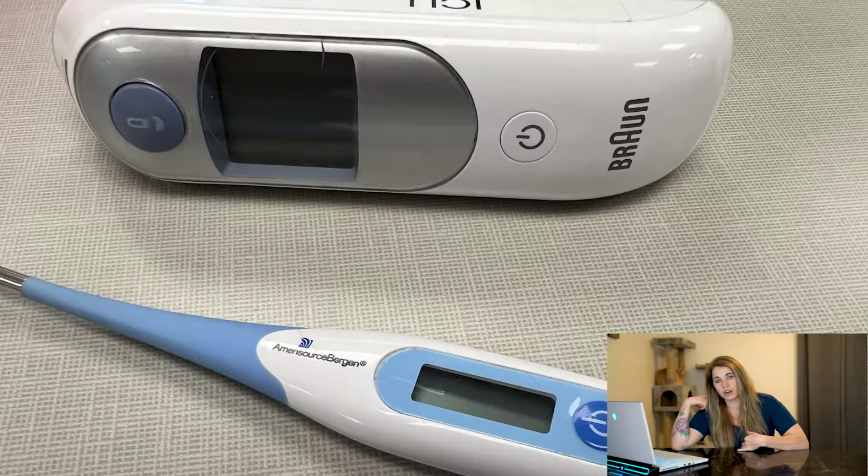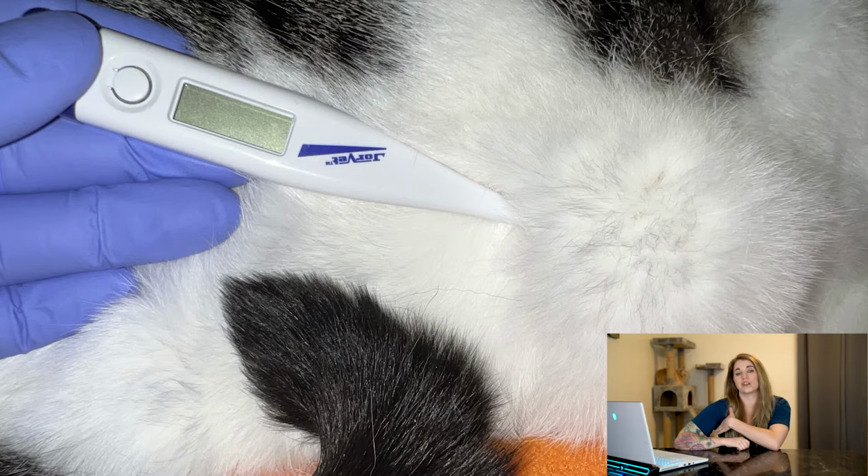So the first component of our TPR is going to be measuring temperature. Temperature can be measured a few different ways. It can be measured rectally, which is the most common way, aurally, and that's AU for in their ear, or axillary, which is the term for measuring it under their armpit. If your patient is anesthetized, you can also have an esophageal thermometer.